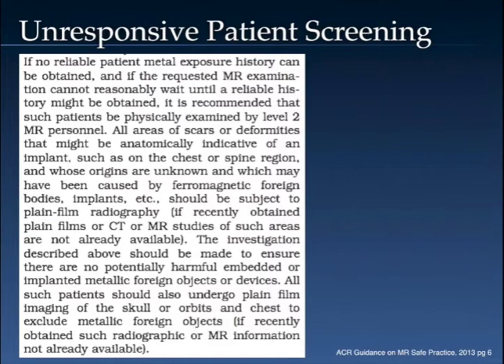And if there's still a question, then the radiologist may want to order some plain radiographs, or if they have previous CT or MRI studies and they have the images to review that might cover these areas of question, then that might be utilized for determining if the patient has any type of an object, an implant device. So I recommend that sites look to the ACR guidance document in developing policies for those types of patients.